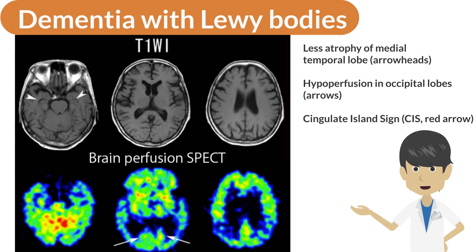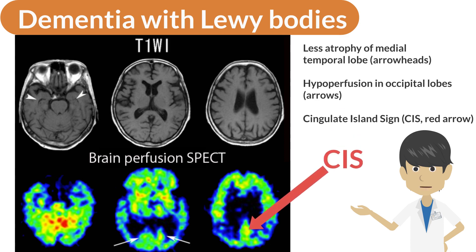In dementia with Lewy bodies, MRI shows less atrophy in the medial temporal lobe, and brain perfusion SPECT shows mildly reduced perfusion in the occipital lobe. Decreased perfusion in the temporoparietal cortex is similar to that seen in Alzheimer's disease, but perfusion in the posterior cingulate gyrus is relatively preserved, referred to as the cingulate island sign.